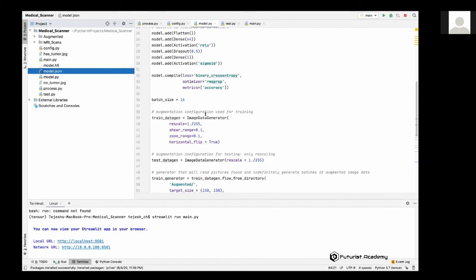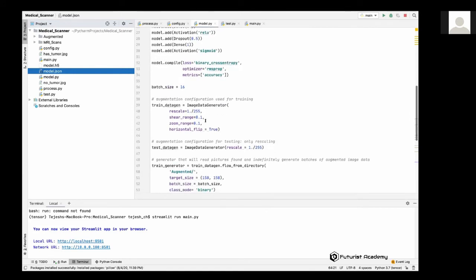And then the third main operation occurring in the back end is the pooling, which reduces the dimensionality while retaining the most important information within the images. And so I wanted to define a spatial neighborhood, so I used max pooling in 2 dimensions and normalized the dimensionality of my dataset to ensure increased accuracy.